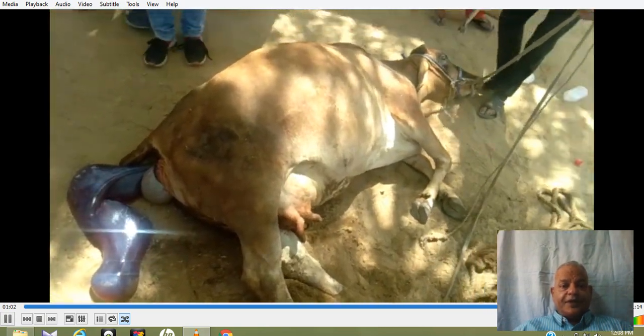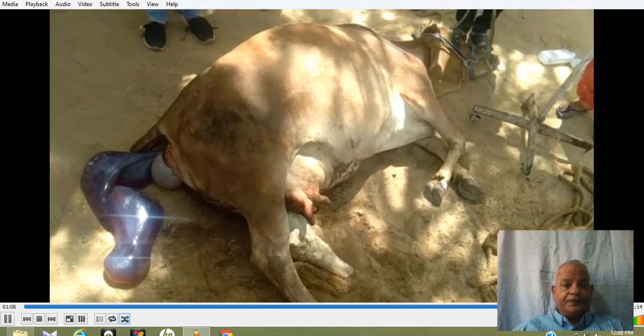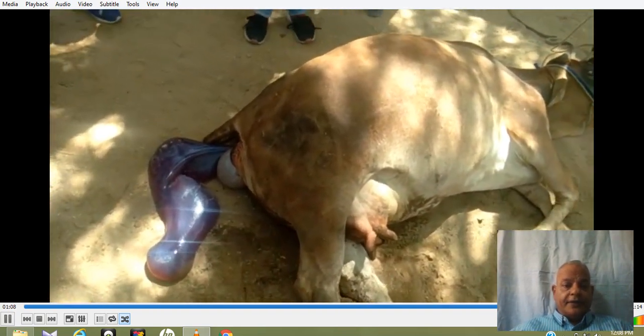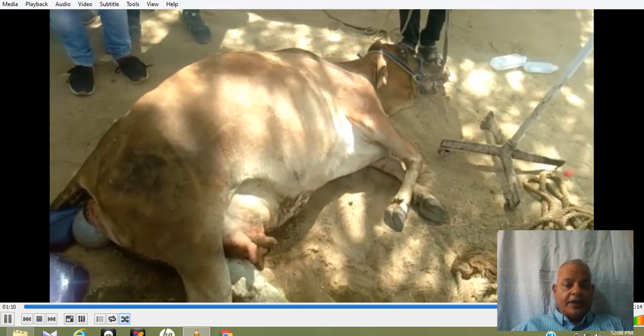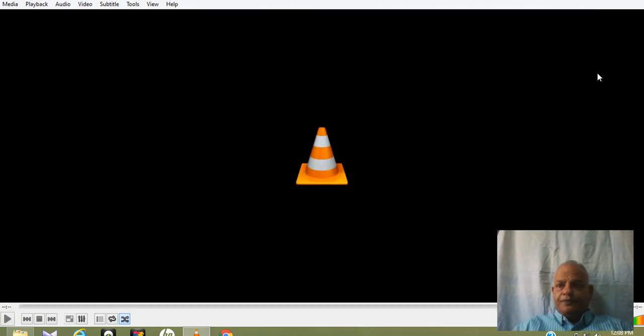Once the uterine torsion is corrected, the alantochorion comes out. Many times blood also comes out. This is how torsion is corrected. Thank you very much.